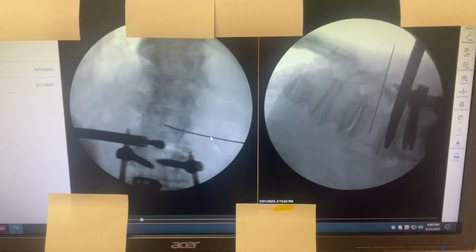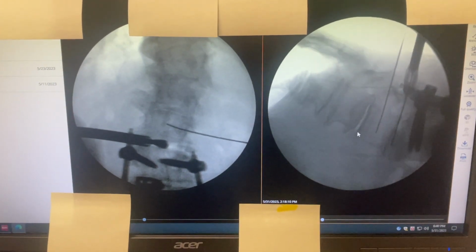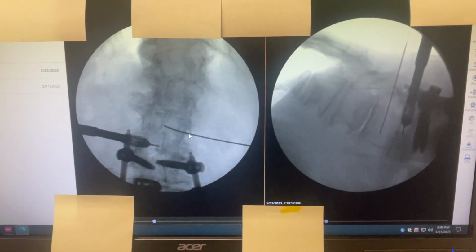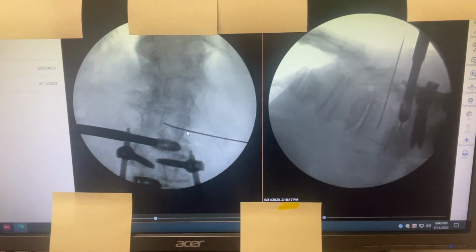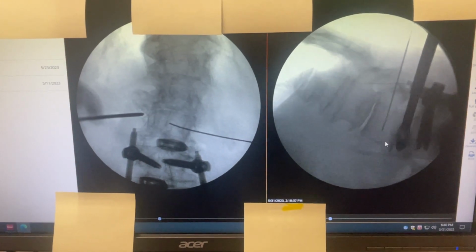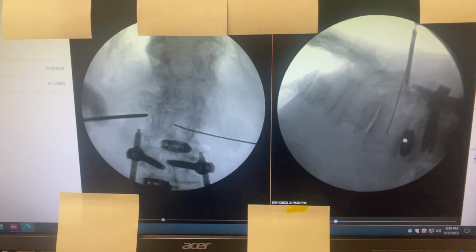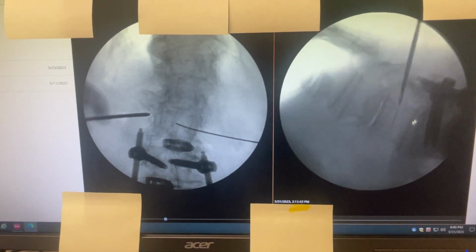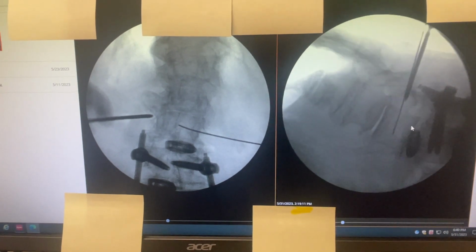Look at when we are dilating, it changed the anatomy and distract the space. We go all the way to the other side. I perform a discectomy, and then here you see the disc base is entered with a cage. I put the cage to the other side to compensate for deformity, and going back here, you see that this space here significantly enlarged after the cage is placed.